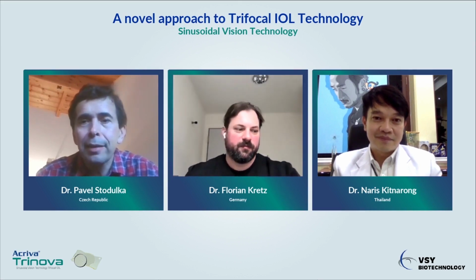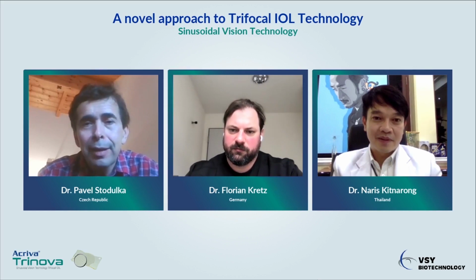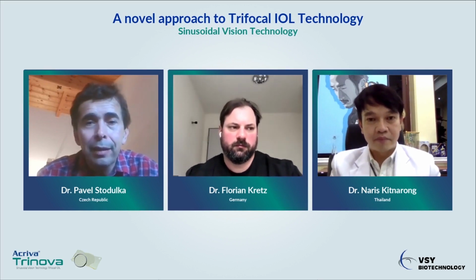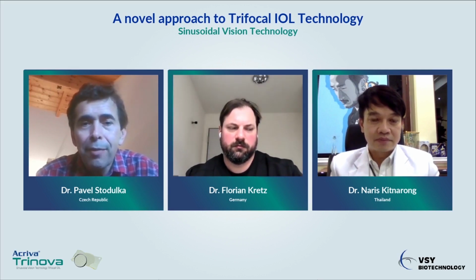That's an excellent answer covering all the aspects regarding the wide pupils. There is one comment, not really an answer, that halo and glare due to the reduced amount of rings and sinusoidal technology is reduced, and the glare and halo is on the level of EDOF IOLs at our clinic, and the combined intensity was less than trifocal diffractive IOLs, but slightly more than monofocal EDOFs.